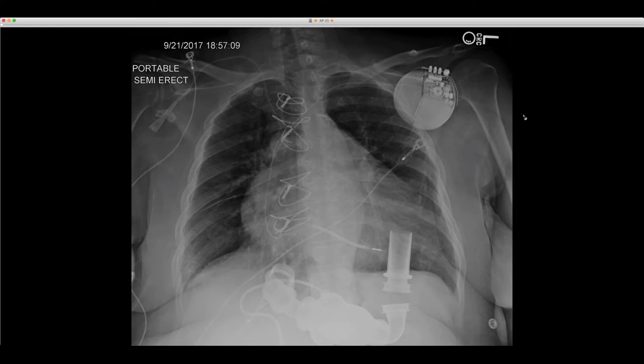Wow. Yeah. So, all right, and here's another case here. This is a HeartMate 2 LVAD, and I thought I'd seen the last few of this particular complication a couple of years ago, but it turns out that I was wrong. You can look at the structure of the inflow here, the little bend relief here, the elbow connectors, and then look at the other bend relief here. Just keep that configuration in mind. And let me go to the CT.